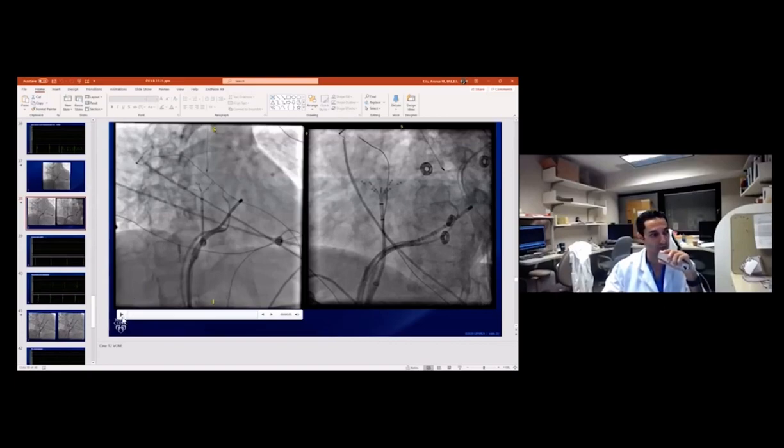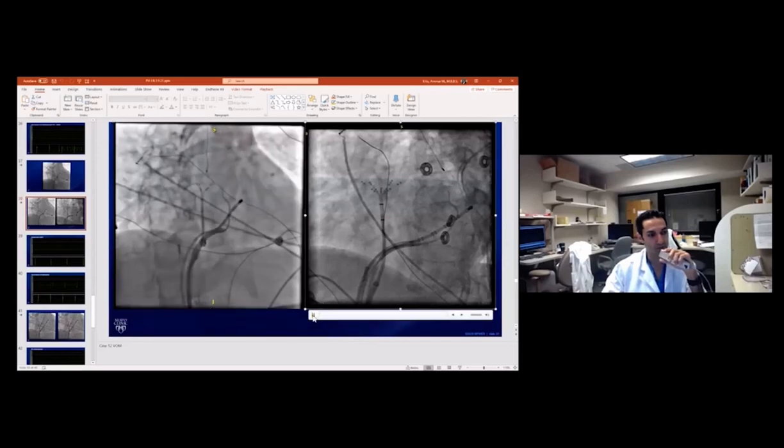So we did an angiogram in the coronary sinus, and we could actually see that there was this structure going right through that ridge. So you can see both the RAO and the LAO, that vessel, which is the vein of Marshall. And after we occluded that and injected alcohol into it, we were able to eliminate dormant conduction in that vein. And sometimes this kind of technique is used for perimitral flutter.